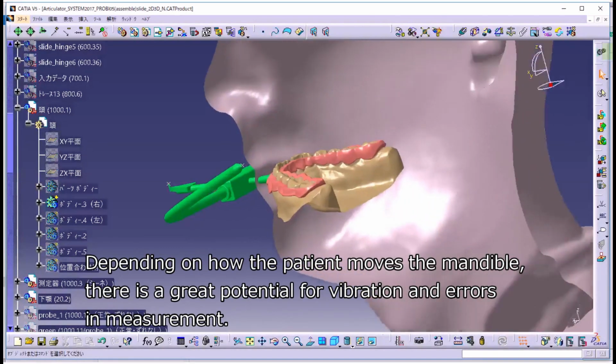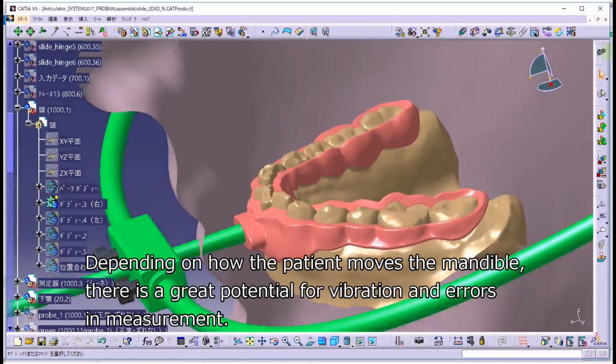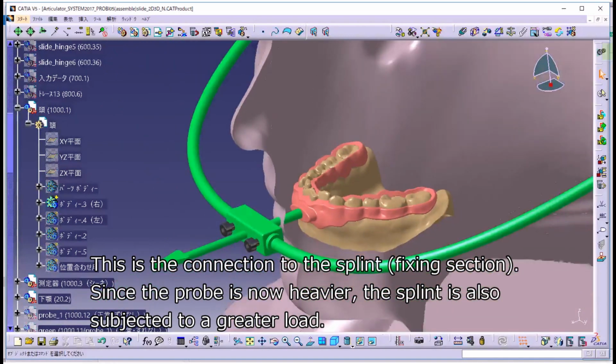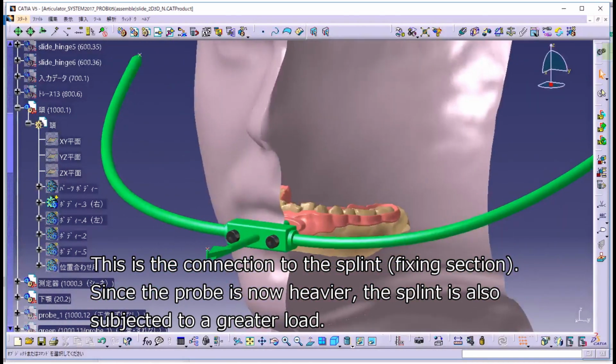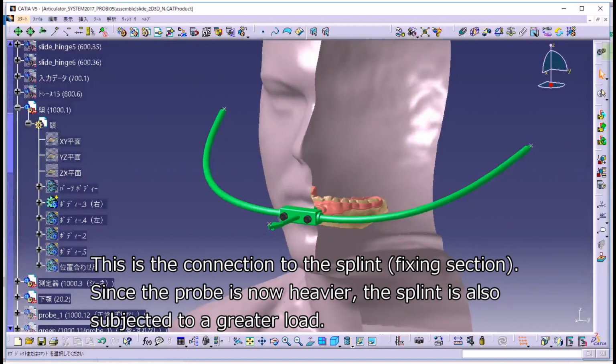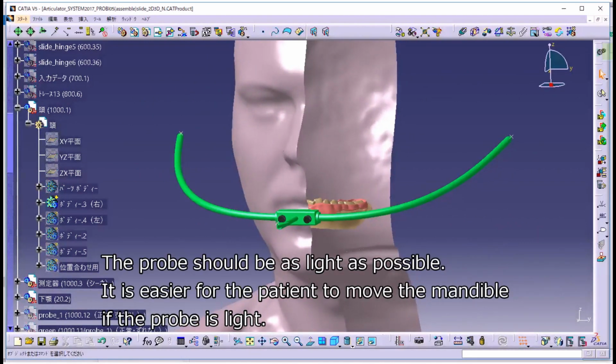Depending on how the patient moves the mandible, there is a great potential for vibration and errors in measurement. This is the connection to the splint, fixing section. Since the probe is now heavier, the splint is also subjected to a greater load. The probe should be as light as possible. It is easier for the patient to move the mandible if the probe is light.